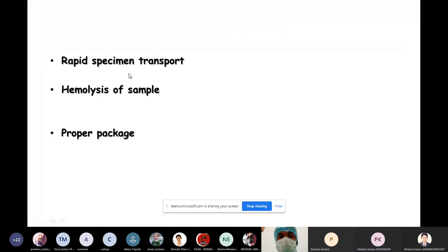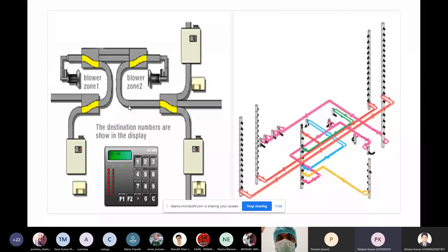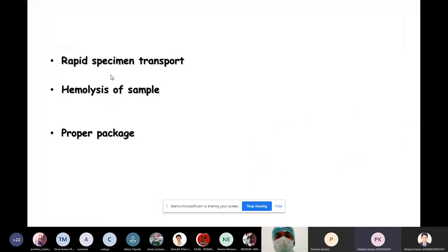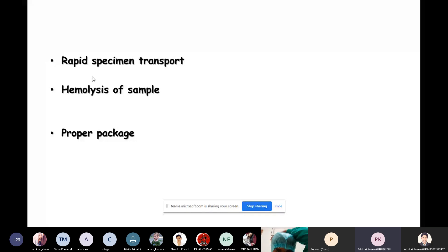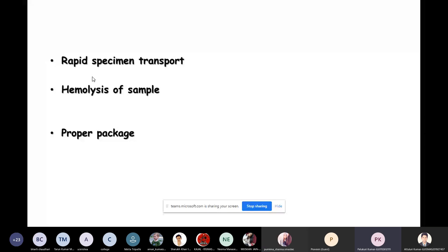The pneumatic system provides rapid specimen transport. However, hemolysis of the sample is a drawback, as the machine carries the container at high speed. Proper packaging — keeping sponge-like material inside the capsule so tubes don't hit the surface — reduces hemolysis and allows tests to be performed properly.